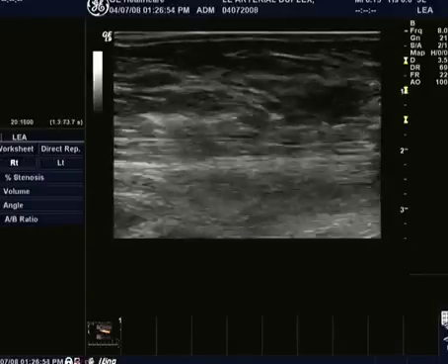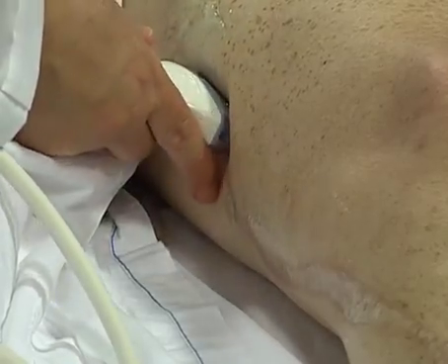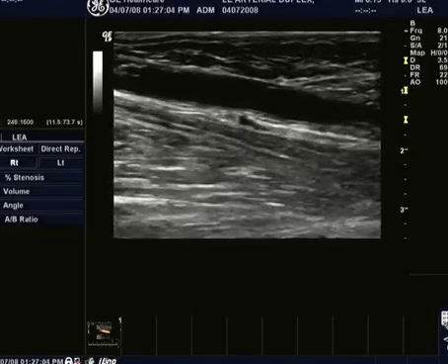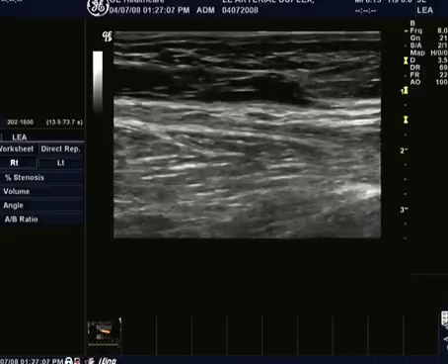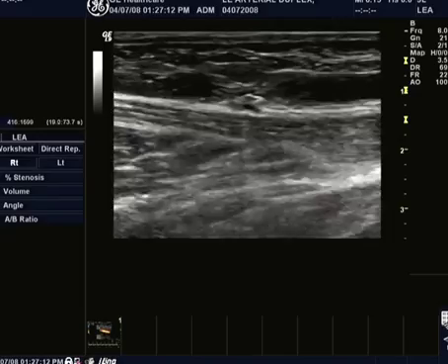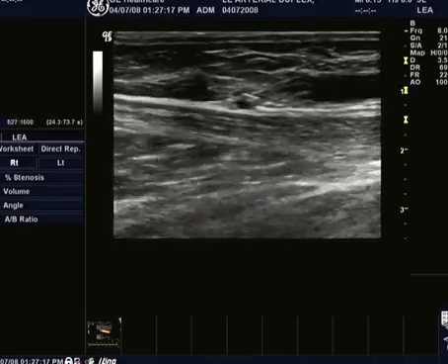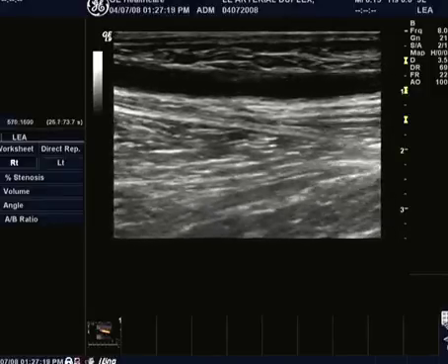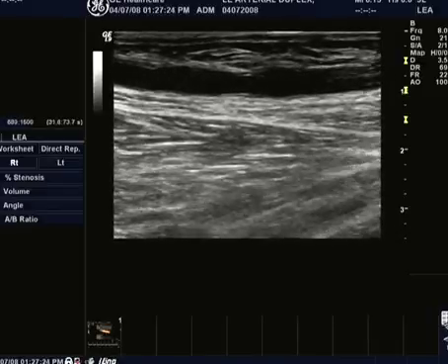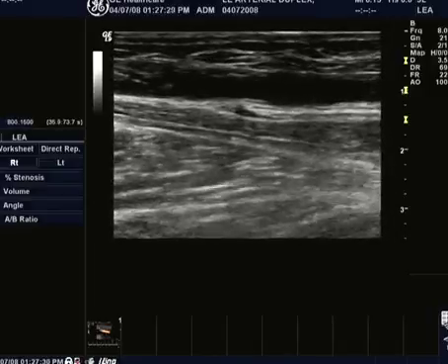And right now I'm about at the middle of his thigh. So let's take another Doppler velocity at this point. One thing to caution, particularly if the vein or the bypass is very superficial, and again, this is reverse vein, but placed very superficial. So this reverse vein bypass, if I push a little bit too much, I'm actually going to compress it a little bit. Maybe you can appreciate how I've changed that diameter just a little bit. So we don't want to press too hard, all right?